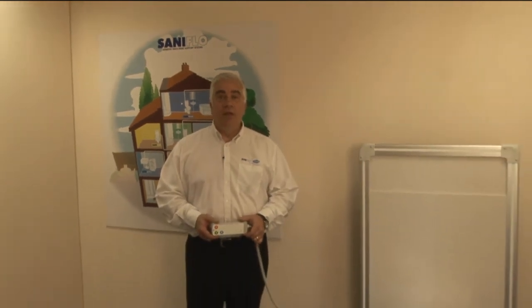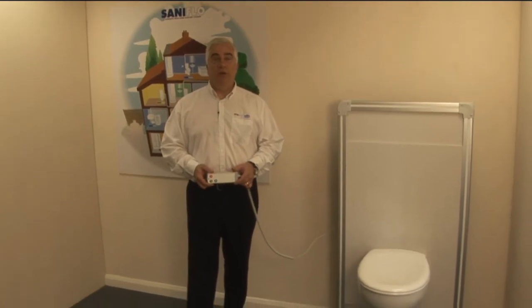SaniMatic is an adjustable height WC system with a control pad that raises, lowers and flushes the WC. It's designed to be compatible with all wall hung WC bowls.